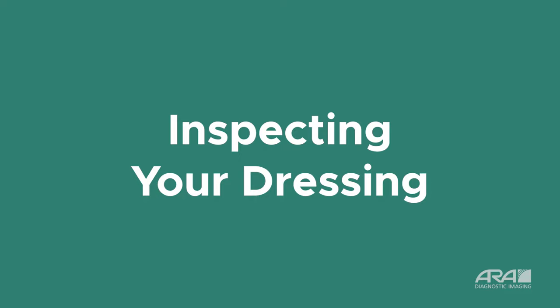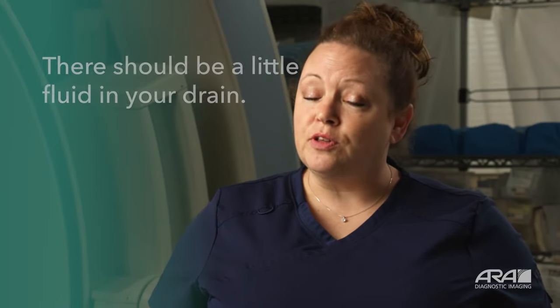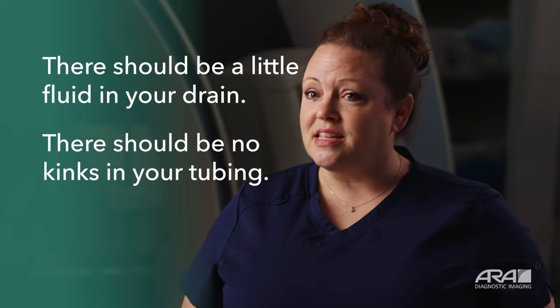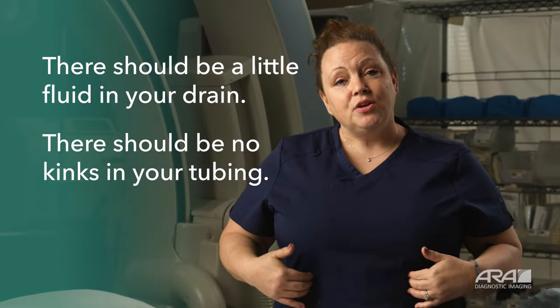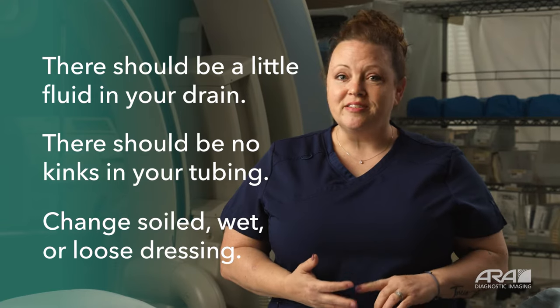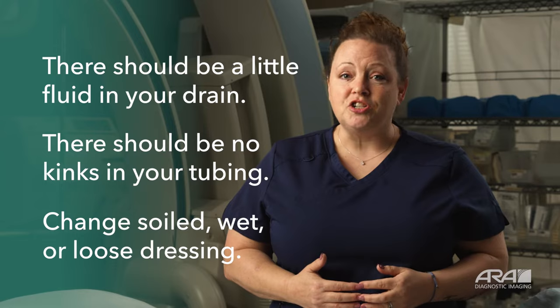Every day, you're going to inspect your drainage system. Find a handheld mirror or a long mirror and use that mirror to look at your drain. There should be a little fluid in your drain — it should be free flowing. There should be no kinks and no bends in the tubing between the drain and the bulb or bag. Inspect your dressing. You want to make sure that if your dressing is soiled, wet, or appears to be loose, that you change that dressing.